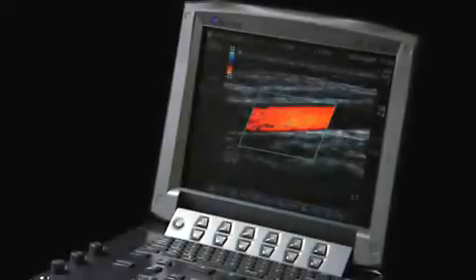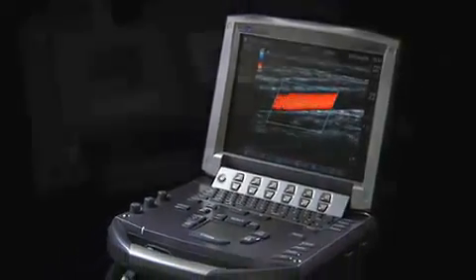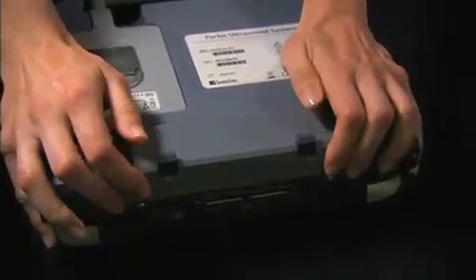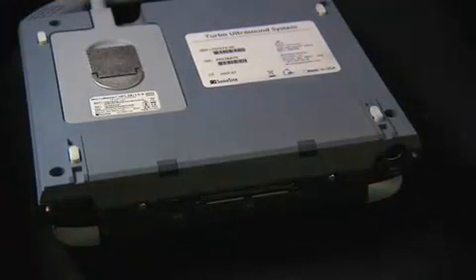The M-Turbo operates efficiently on either AC or battery power. To install the battery, turn the system upside down. Slide the battery into the battery compartment until it locks into place, then push down on the two locking levers to secure the battery.